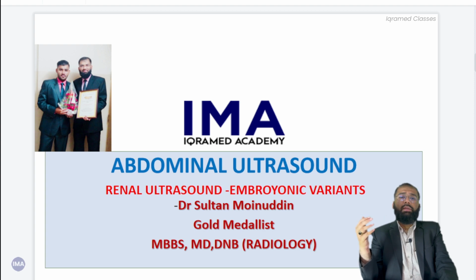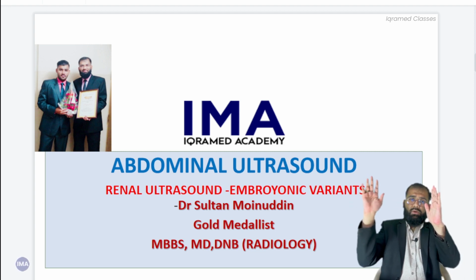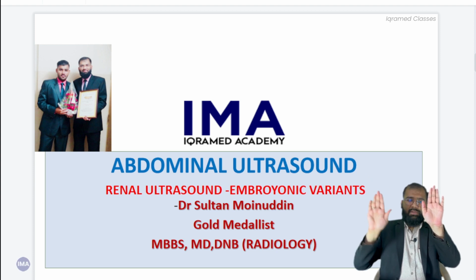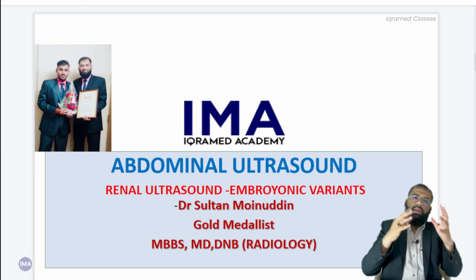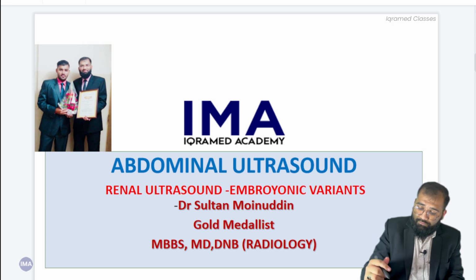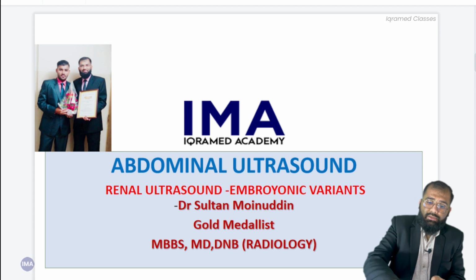Like sometimes the kidneys might be a horseshoe kidney, or you might have abnormal location of kidney like in cases of ectopic kidney. Sometimes the kidney might be absent, which is called renal agenesis. Sometimes the kidney on one side may be absent and it is fused with the one on the right or left side, whatever. So that is called cross fused ectopia. All these embryological variants we will be seeing in this session. So without any delay, let us begin.